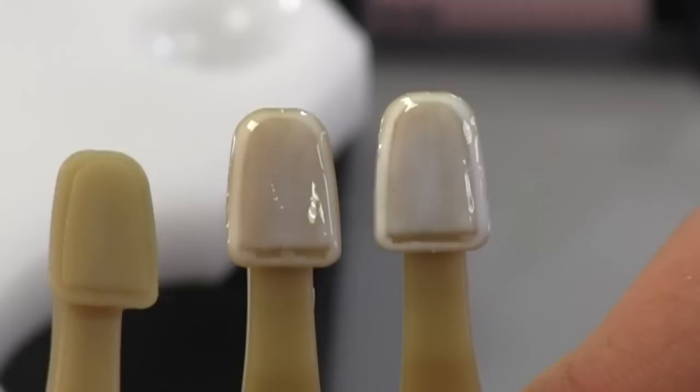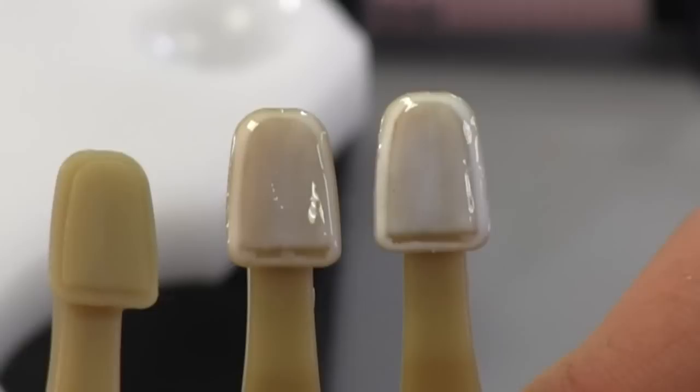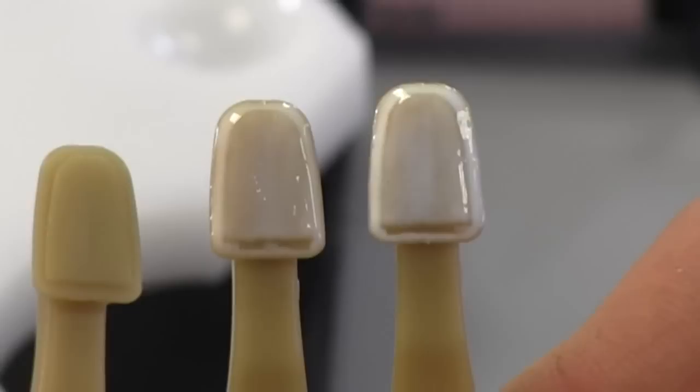If you notice, on the far left we started with our C4 shade tab. Then in the middle we placed our Pink Opaque, and on the right we placed our White Opaque. As you can tell, between the Pink Opaque and the White Opaque, the Pink Opaque tends to be warmer — it absorbs more of the underlying color.